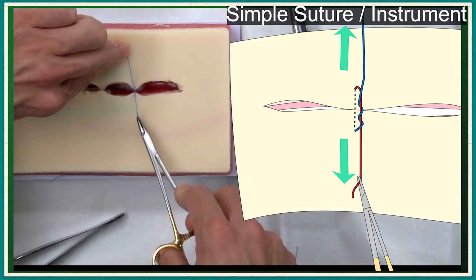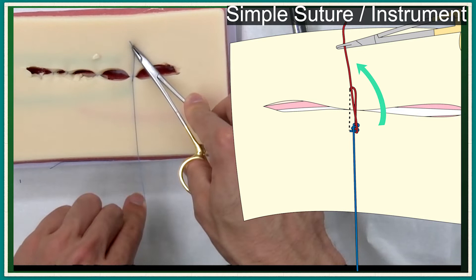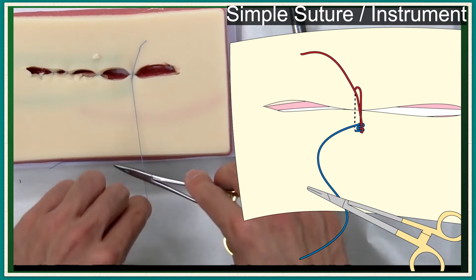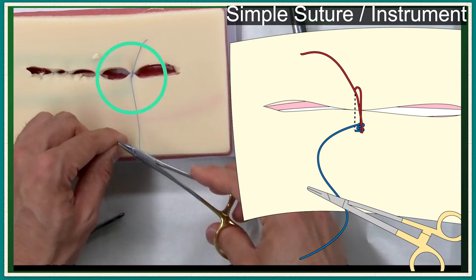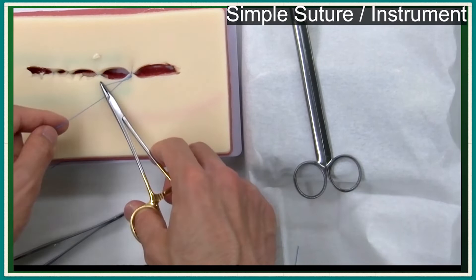Set the suture tension. Pull the left hand end back and pull downward. The knot is locked. Then another end with the needle holder is pushed forth to form another lock. Release both ends of the suture. The tension is held. The knot is secured by additional instrument knot tying without pulling the suture ends.